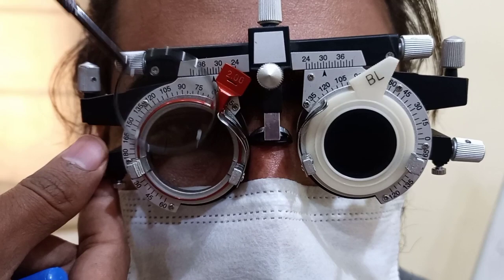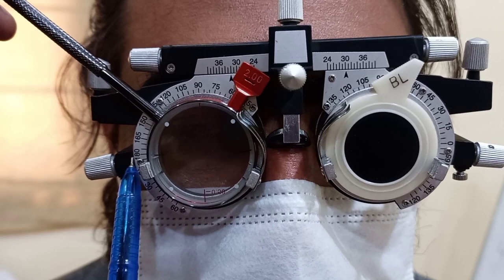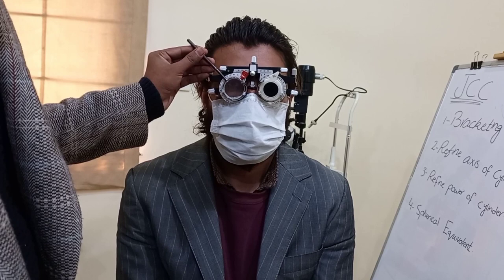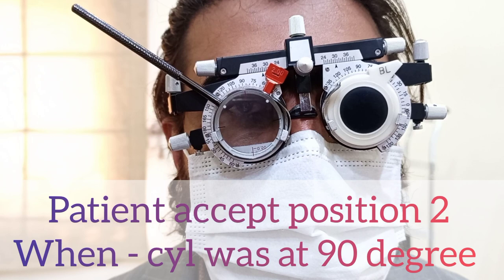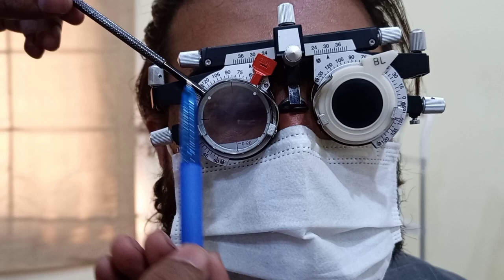When I flip the Jackson cross cylinder at the same position, the minus line is now at 90 degrees and the black line of the plus cylinder is at 180 degrees. We again ask the patient: 'Is the line on the Snellen chart clearer and darker at position number 1 or position number 2?' The patient responds it is clearer at position 2, where the minus line was at 90 degrees. So our rough axis from bracketing is 90 degrees.